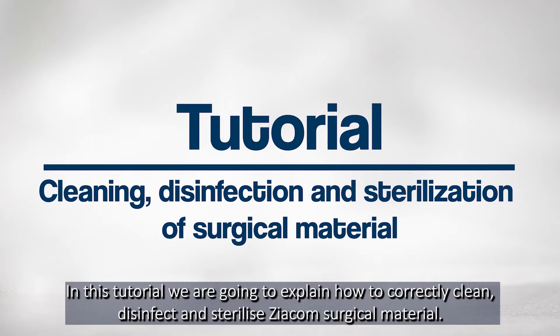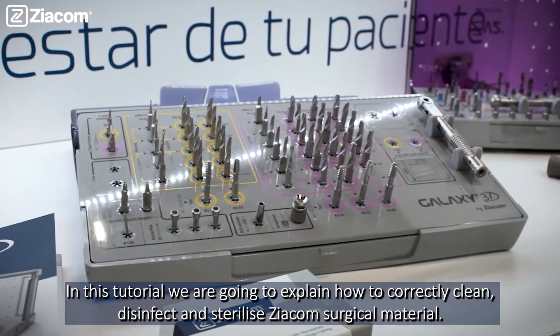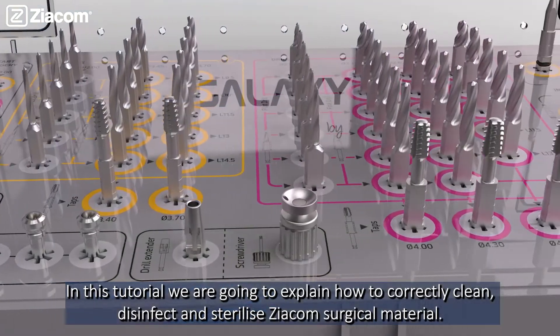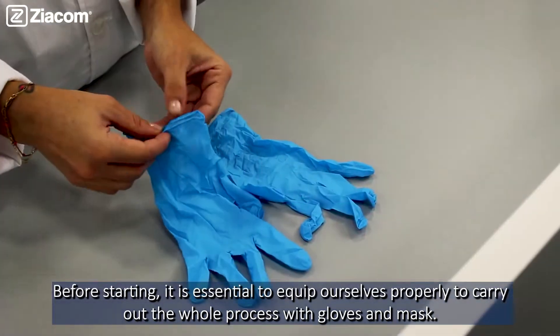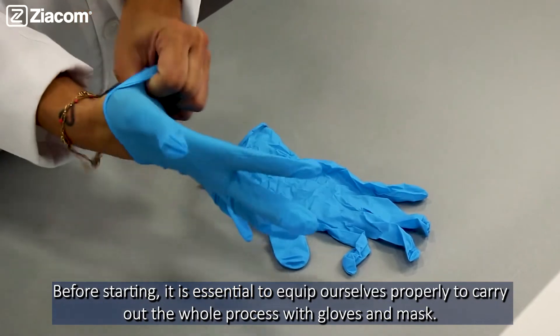In this tutorial, we are going to explain how to correctly clean, disinfect and sterilize Siacom surgical material. Before starting, it is essential to keep ourselves properly protected to carry out the whole process with gloves and masks.